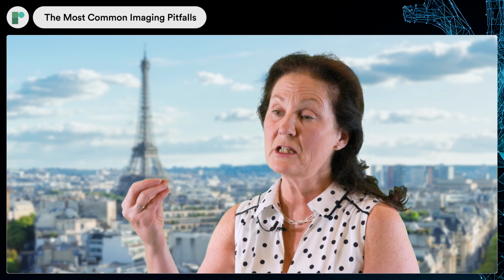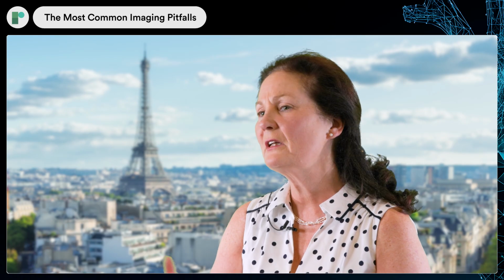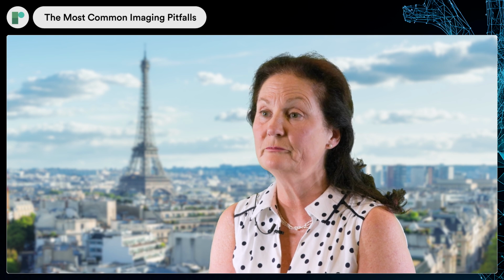At the same time, the guide sheath can get in the way of the imaging from the TOE probe, and it can create some acoustic shadowing over the mitral valve annulus itself, and therefore it can make the imaging tricky, which is where multiplanar reformatting imaging comes in handy, because at least in some of the views you'll be able to see where we're going. The other thing is, of course, when the valve is being deployed, to try and follow that in real time. Again, that can sometimes be a little bit tricky with TOE positioning, to make sure that you can see the device being fully expanded without the acoustic shadowing that occurs naturally with the guide sheath position.